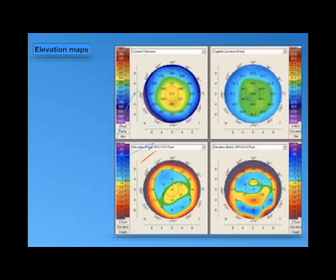And in the margin from +15 to +21, it could be suspected, but it's more accepted in the hyperopic than the myopic. But beyond 21, it's abnormal. It's not accepted in both because of the type or the amount of refraction of the rays coming from the machines related to curvature myopia and curvature hypermetropia, the nature of the refraction of the light in both corneas.